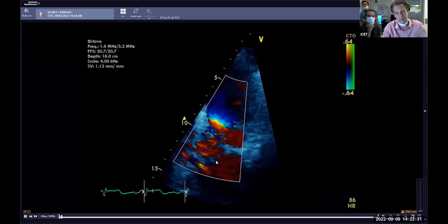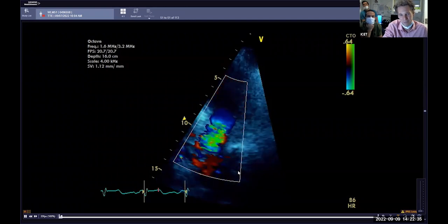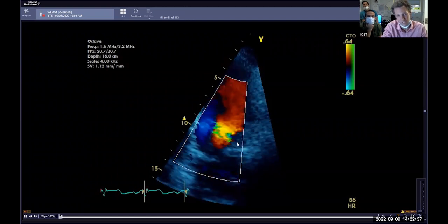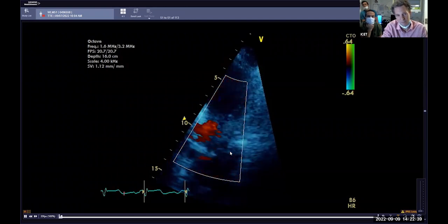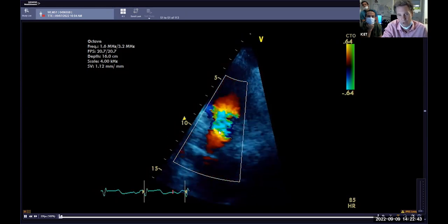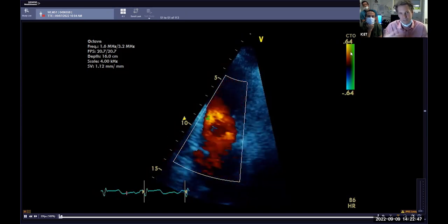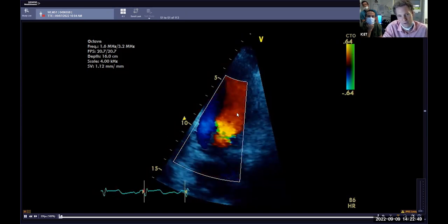And this is what I love about looking at these formal studies of other people who know what they're doing and really beautiful studies, is they're trying to tell you a story, right? So here, they're starting off by telling me, let's focus in on the LVOT. We've clearly got chaotic blood flow here as shown by all the green stuff, the variance, if you like, but I think you can still see it if you don't have the variance on.